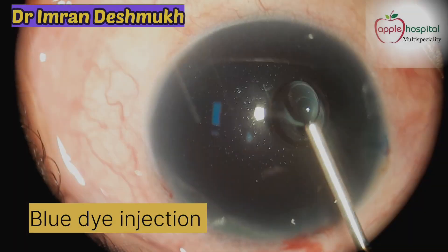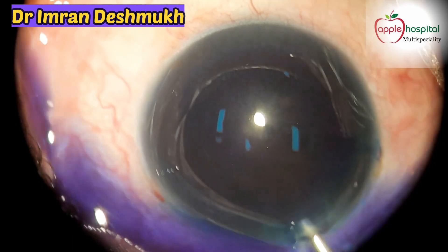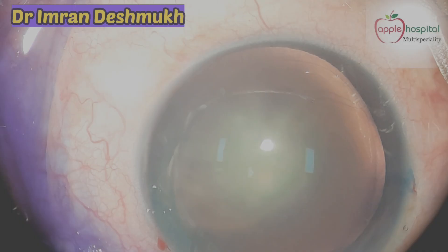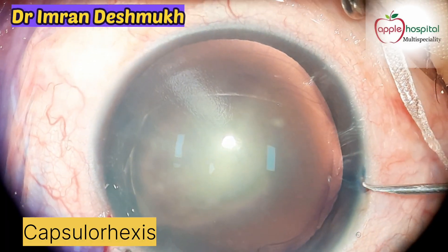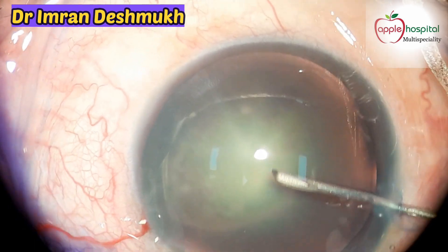Now it's time to use the blue dye to stain the anterior capsule, so that while making the capsulorrhexis it becomes a bit easier. Inflate the anterior chamber with viscoelastic — but don't over-inflate.